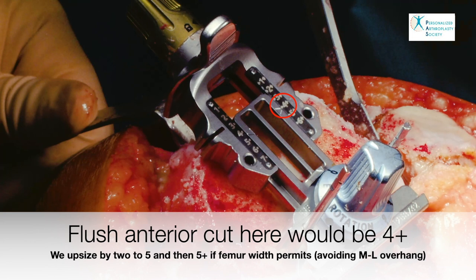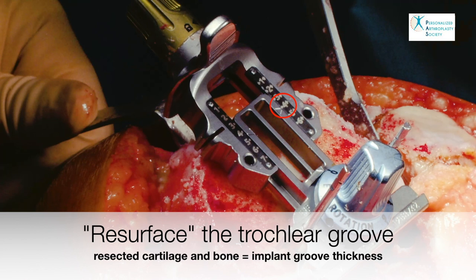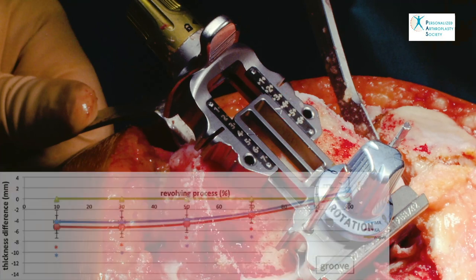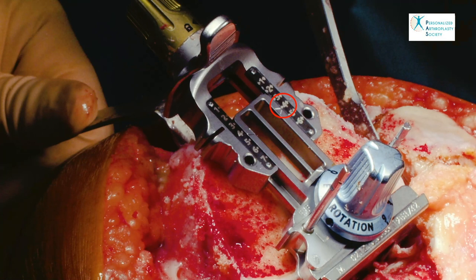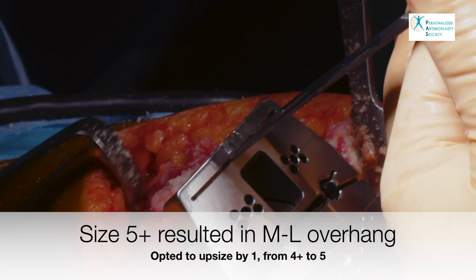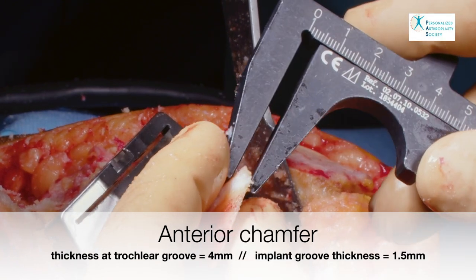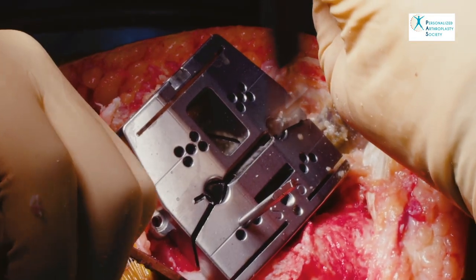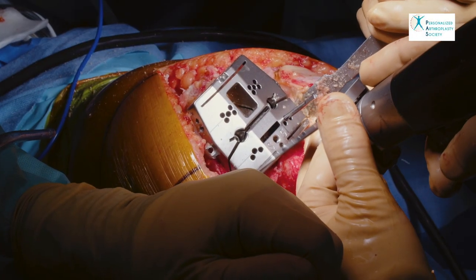I'm just going to pause here because this is what makes this technique special. We apply the principles of resurfacing the condyles and tibia to the trochlear groove. Generally, at the level of the anterior chamfer cut where the patella engages, we remove more trochlear thickness than what we put in with a standard flush anterior femoral cut. The thickness of the prosthetic trochlear groove of this implant is only 1.5 mm thick. To optimize patellofemoral offset and tracking, we aim to resect only 1.5 mm of trochlear in the anterior chamfer cut. To do this, we upsize the femoral cutting guide and component by two sizes above the usual flush anterior reference.